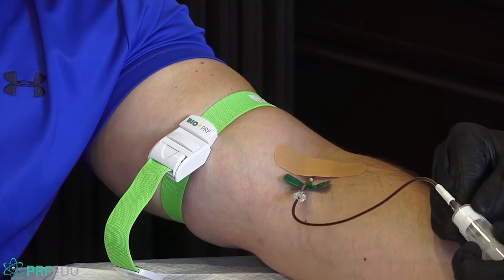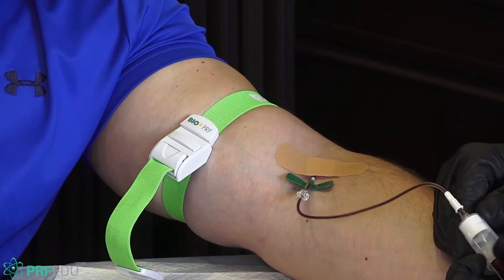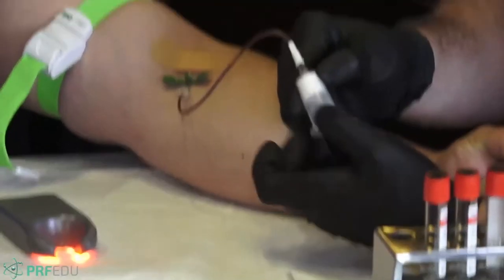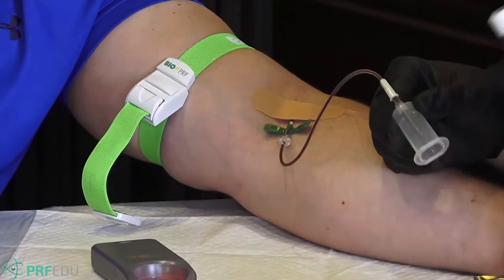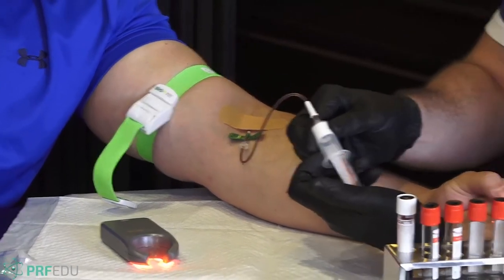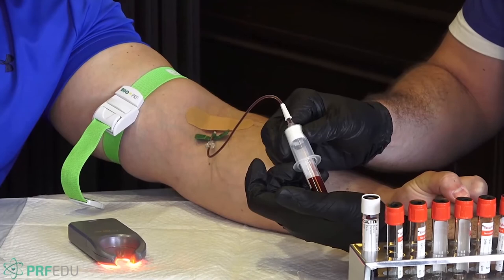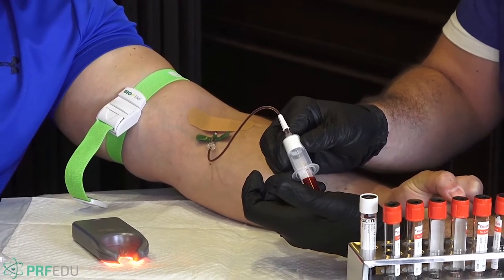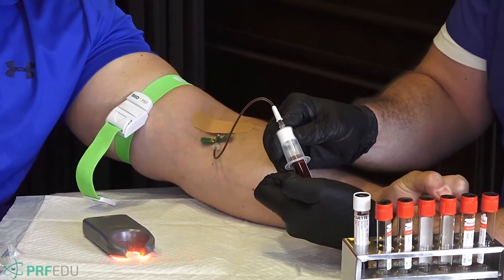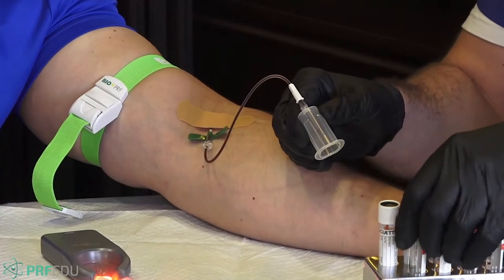Okay, so Carlos is a healthy individual, going very, very quickly. I don't know if you guys can see that over there. Okay, so they're filling up. That's the first one. And typically the different tubes will have different vacuums, and we'll talk more about that throughout the course. The vacuum in the tube is very important, and what level to fill it to. These ones here have little black lines that we can fill them to. Okay, so once we reach the black line, there's the next tube.